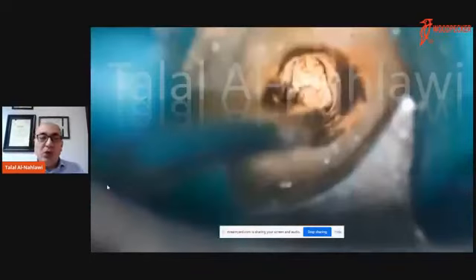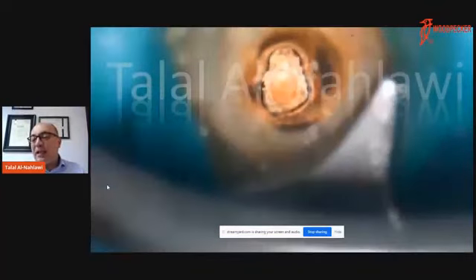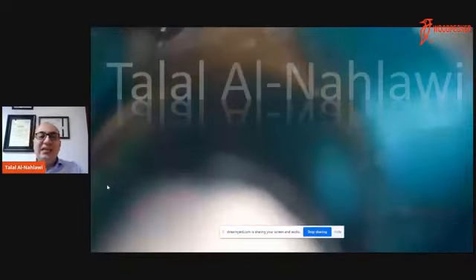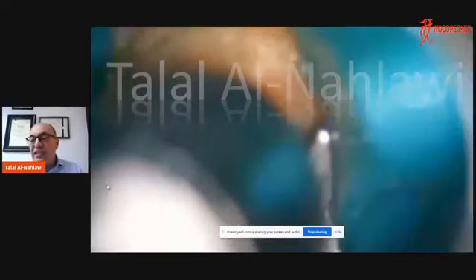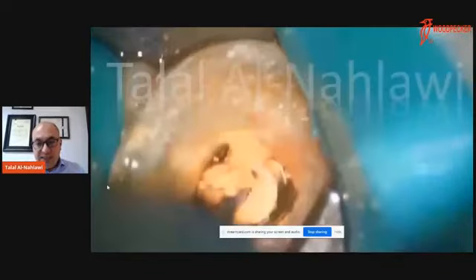The techniques we know, you can go with rotary files, or you can heat the remaining part and then go with rotary files, which will be easier. I recommend to use the tip of the System B to penetrate the gutta-percha, and then you go with rotary files in order to remove the remaining part of the gutta-percha, as you can see here in this clinical case.